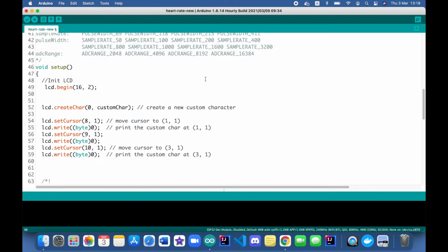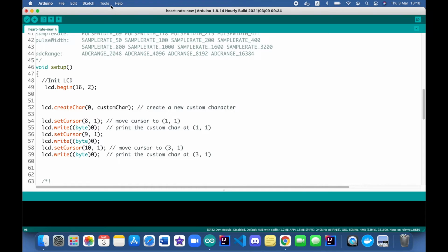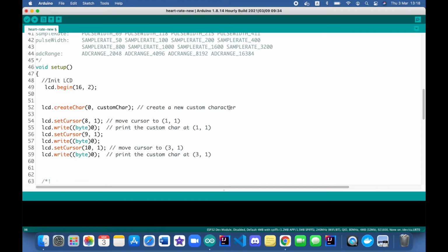You can combine those examples, the basic read and the heartbeat plotter, and then when you want to see the plotter, you can use the plotter tool, and if you want to use the monitor, then open it in the monitor. I don't want to test it on this one, but you get the basic idea here.